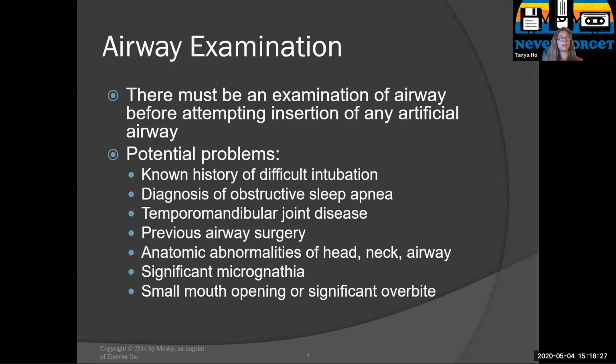Okay, and any anatomic abnormalities of the head, neck, or airway. So people who have kyphosis or kyphoscoliosis, or if they have osteoporosis and they're stuck like this, you can't extend the head and the neck back in order to do your head tilt chin lift.